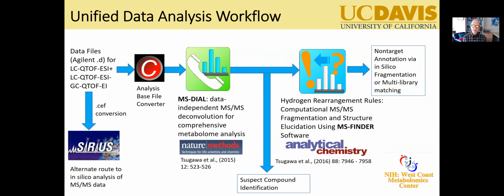It's very effective, but I'm not going to be able to talk about it much today because I've got too much to cover. But it's important to know that especially once you get to this in silico MS-MS analysis stage for non-target, it's important to use multiple platforms and cross-compare the results that you get. And as you'll see, we're still working on that piece of this particular puzzle.